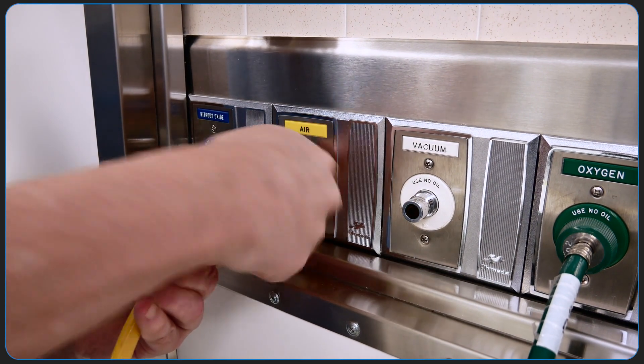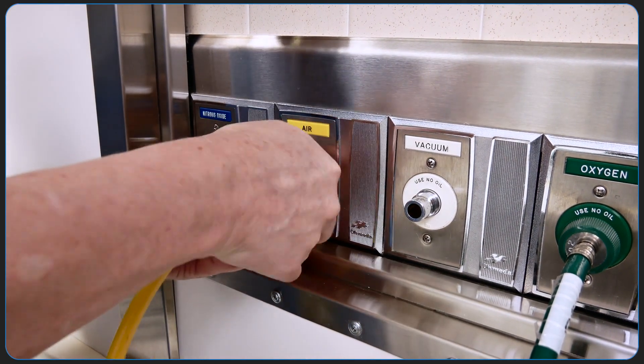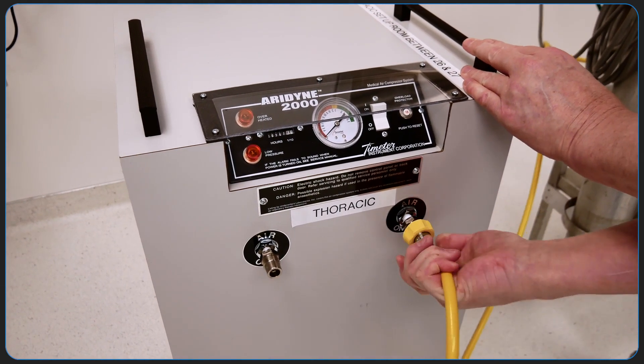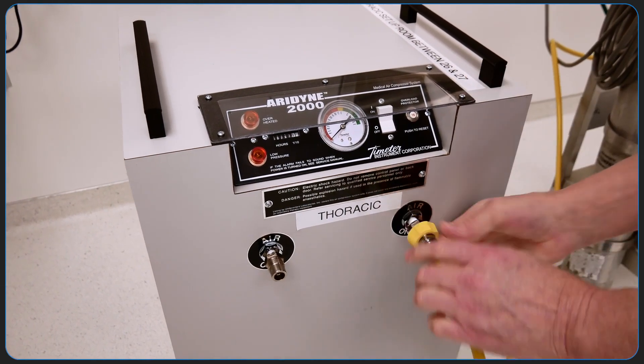The Monsoon ventilator requires connections to both air and oxygen supply tubes to the back of the apparatus. If pipeline air is not available, an external air compressor should be used.